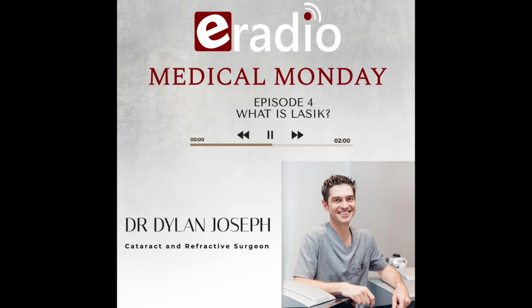Dr. Joseph, laser vision correction is commonly used to get rid of spectacles, right? But are there other applications for the laser as well? Yeah. So spectacles, obviously contact lenses is another mention. Reading glasses, once you're above 40, 45, those are what we call the refractive applications of laser technology. But then we get to therapeutics. Now, therapeutics is a massive discussion on its own.